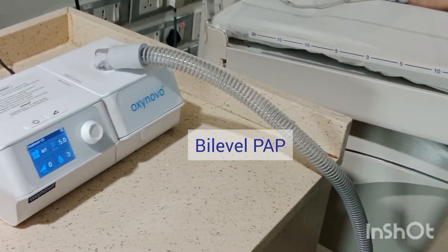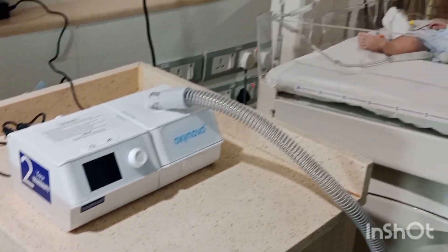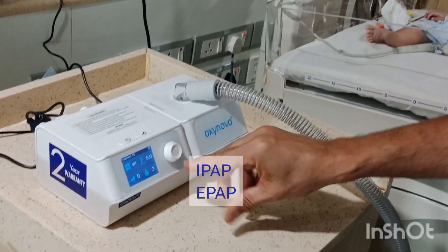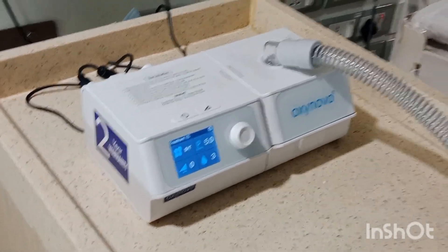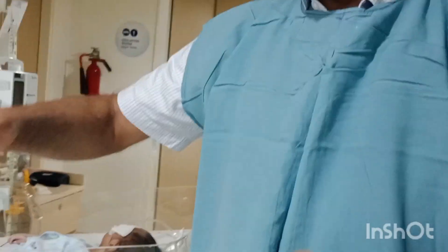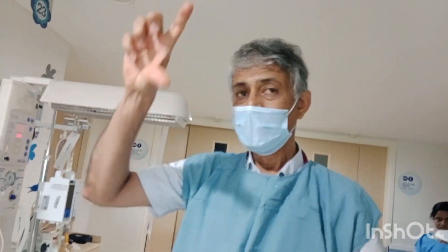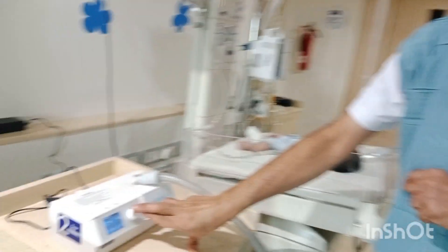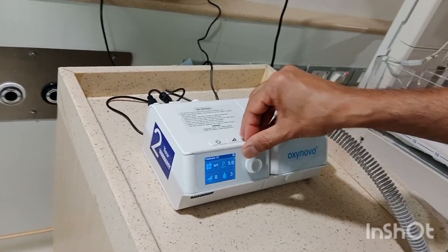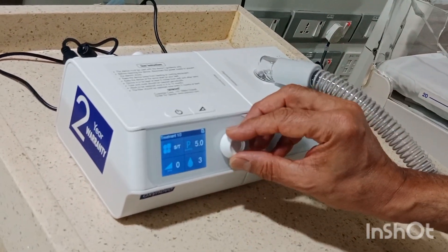You can see 10 and 5 on the display. The value 10 is the inspiratory positive airway pressure, called IPAP, and 5 is the expiratory positive airway pressure, called EPAP. The difference between inspiratory and expiratory pressure is around 5, which is why it is called bi-level positive airway pressure.